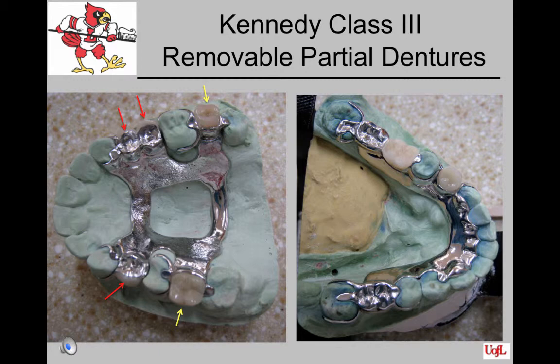In the picture on the right, you see examples of a metal tooth replacement on number 18 and 30, and tube teeth on numbers 19 and 21. If number 30 and number 3 oppose one another, you will see more rapid wear on tooth number 3 because of the dissimilar materials used opposing one another. The tooth with the most resistance to wear will break down the weaker one, and the resin tooth will show wear faster. A facing could have been used on number 3, and then the metal would oppose metal, and the case would retain occlusal contact longer in this area.